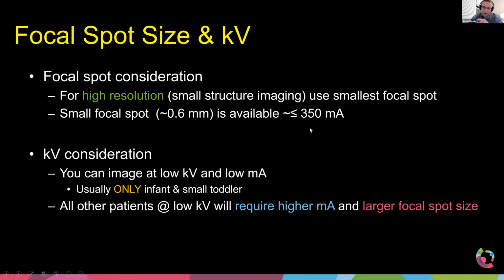It's a small price to pay, but know that if you need really fine imaging, so we're talking about maybe we're imaging a neonate or a little baby, or maybe we're doing MSK stuff where we're really looking for fine hairline fractures in our bones. Well, in that case, you really want to make sure the MA never goes over 350. And so in that case, potentially, you keep the KV at 120. And therefore, the system would not need that higher MA.